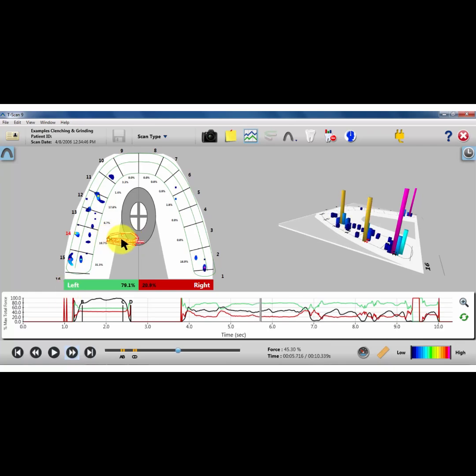So the center of force will show you the direction the patient is moving. Watch it carefully go away from tooth number 14 after it rises drastically in force, and now he moves back towards MIP. That's what this circular loop is: each time he moves towards 14, and each time he moves away from 14. So the problem contact is the mesiobuccal.